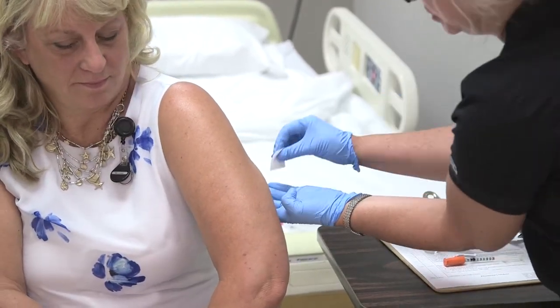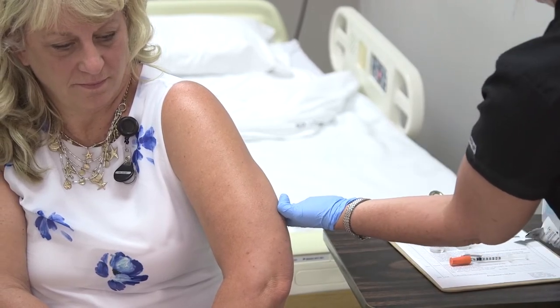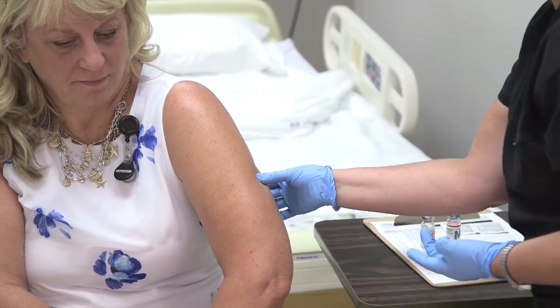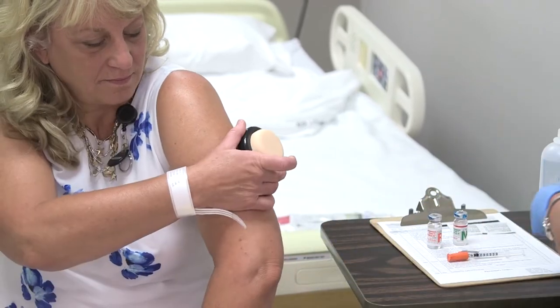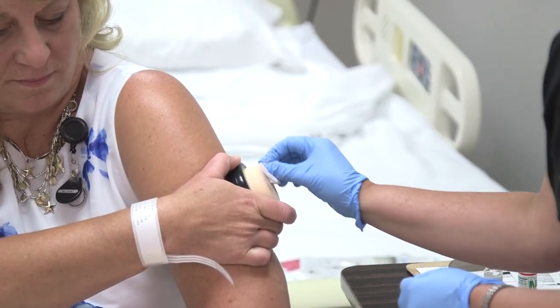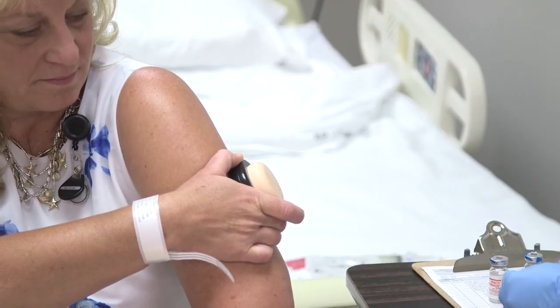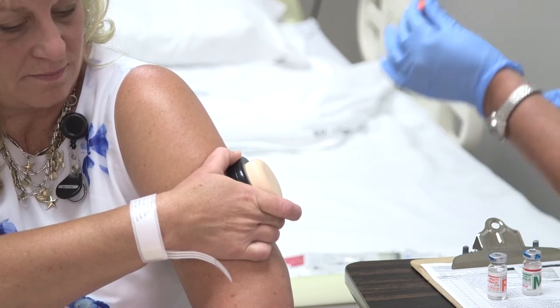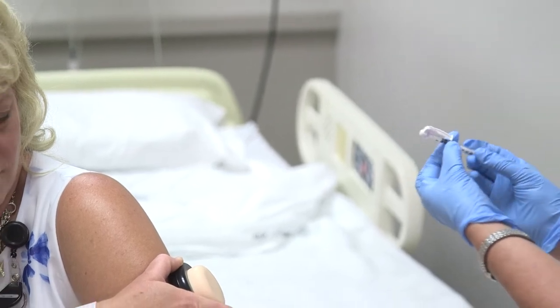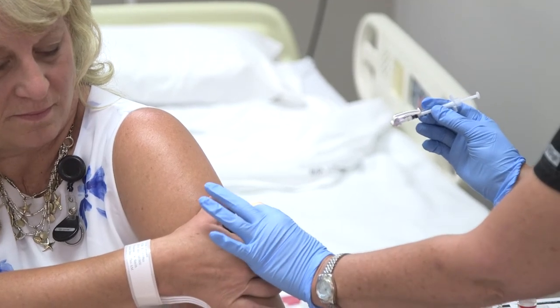I'm just going to clean your skin — you would go in a circular motion. You want to let that dry. And you would also want to pinch the area, but we're going to use that for training purposes. We'll clean that off and let it dry. You want to look for the bevel up before you inject. This is with a needle, not a pen. We're going to squeeze the area just to get the fat to come up to the surface.